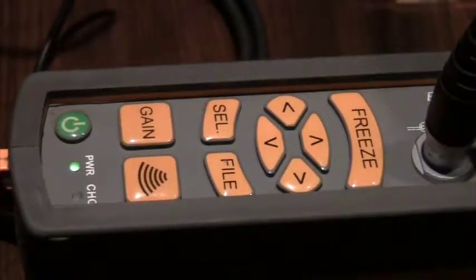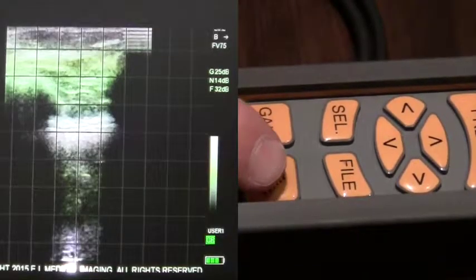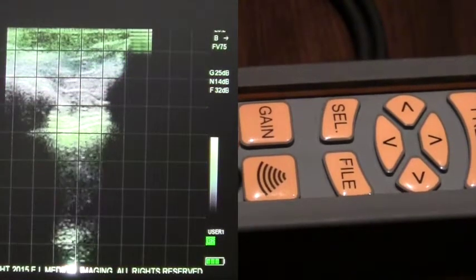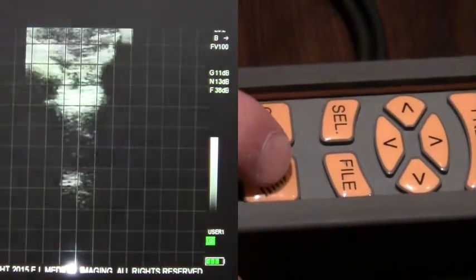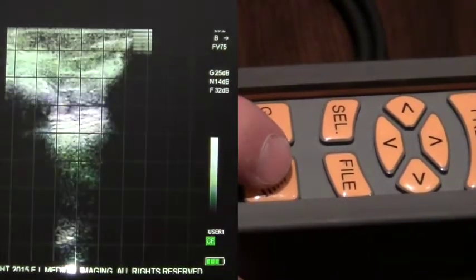To adjust the field of view on the IBEX light, hit the field of view key. Notice in the upper right-hand corner your field of view is indicated by FV75. By hitting the button, you simply round-robin through the four different settings of field of view.